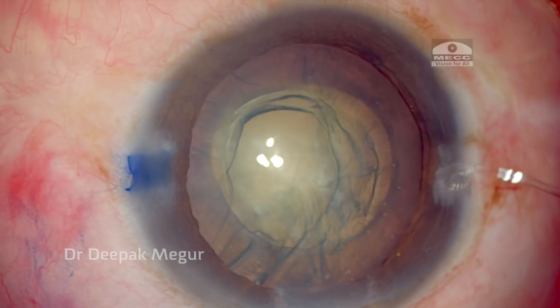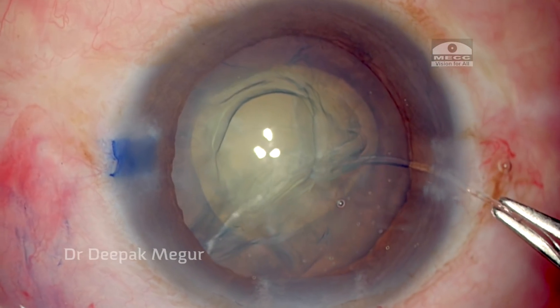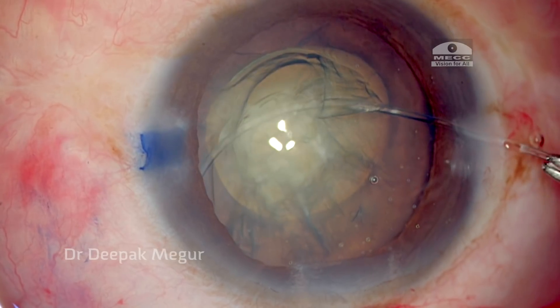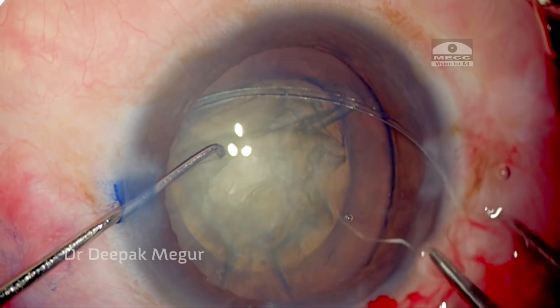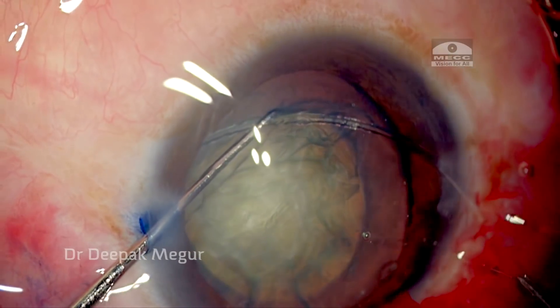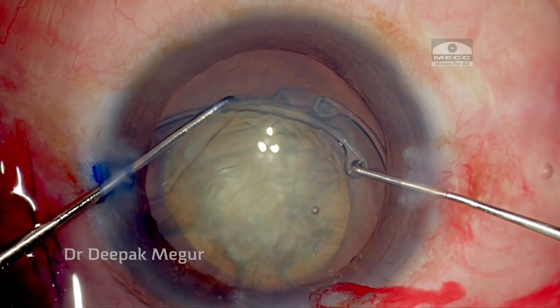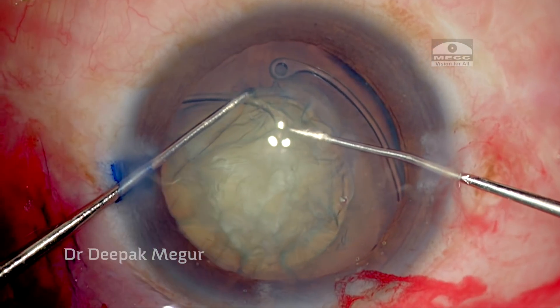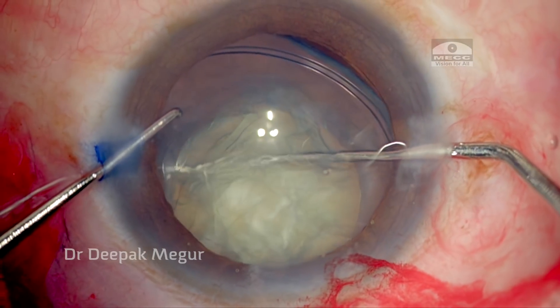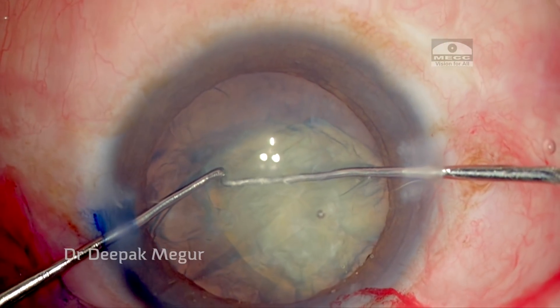Having done that, I want to insert the CTR at this stage, before proceeding further. I first inject OVD to create space under the anterior capsule, then the CTR is threaded into the bag. I use my left hand to support the ring and compress it slightly so we don't put excessive stress on the healthy zonules. Care is taken that the CTR is dialed across the weak zone, ensuring the entire weak area is adequately supported.